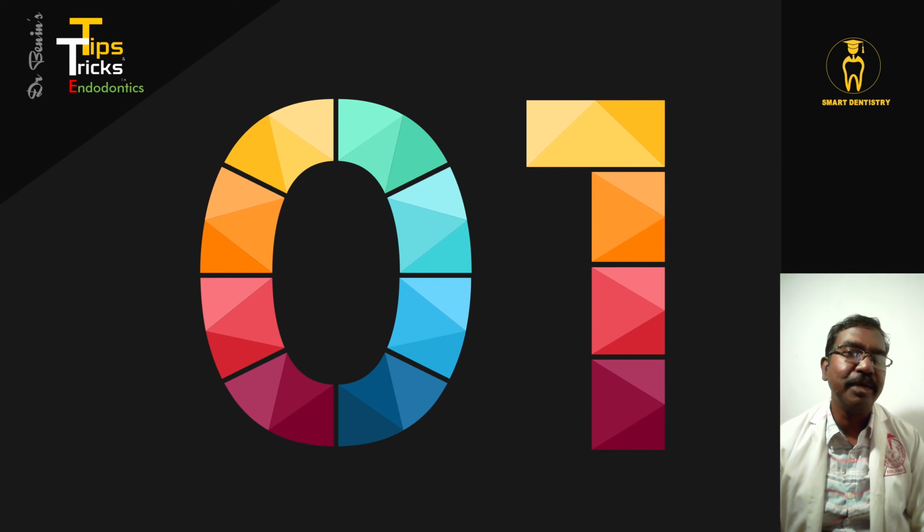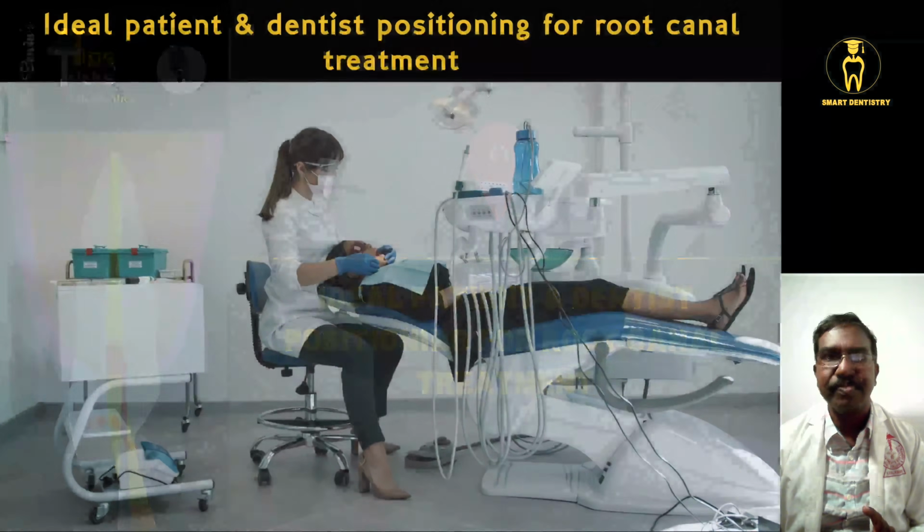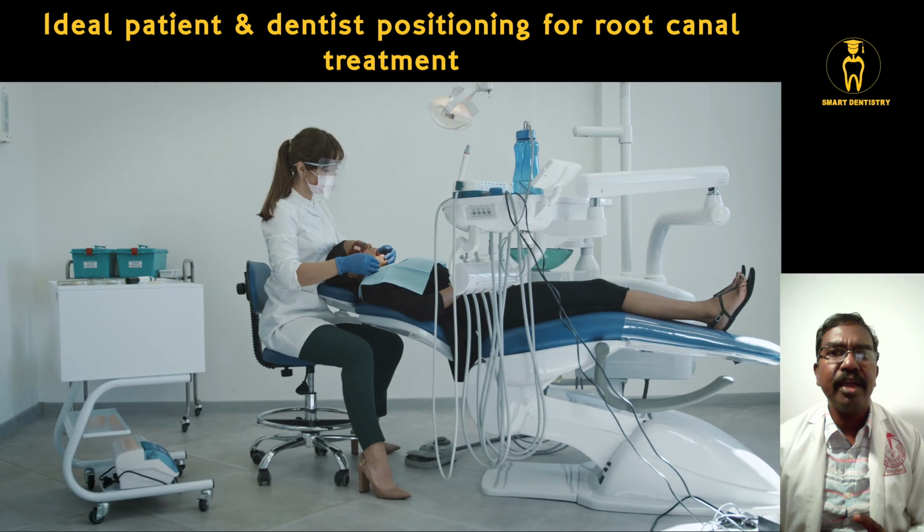The first tip which I am going to give is about the ideal patient and dentist positioning while doing root canal treatment. We would have often seen that the dentist makes the patient sit in an upright position, or maybe in a reclined position, while doing various dental procedures.